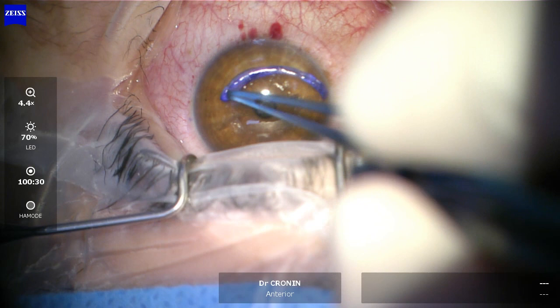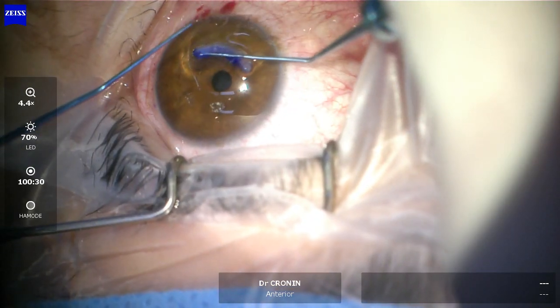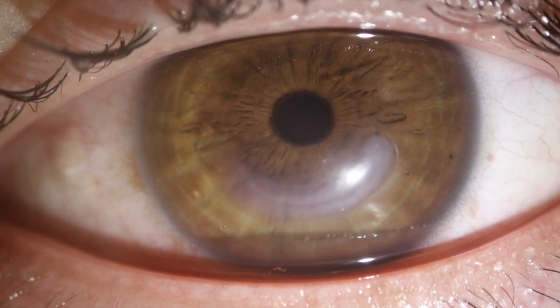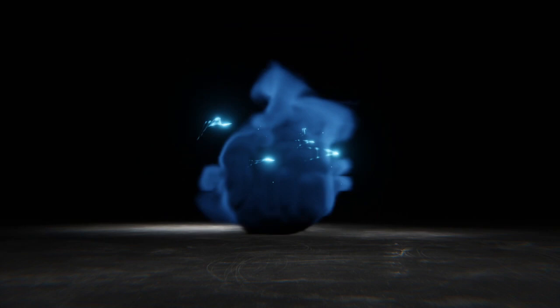The tissue has been stained purple here to assist in visualization during the operation. Remember, you're asleep for this. The idea of the procedure is that this significantly improves your vision in glasses. Sometimes further procedures are needed. This is an image of the eye the next day. Normally patients are quite comfortable the next day, and often seeing better already.